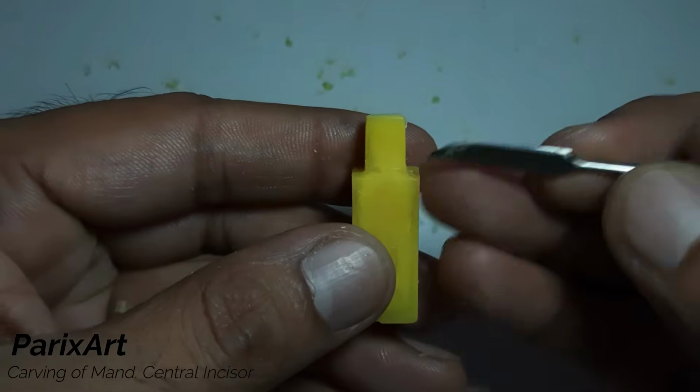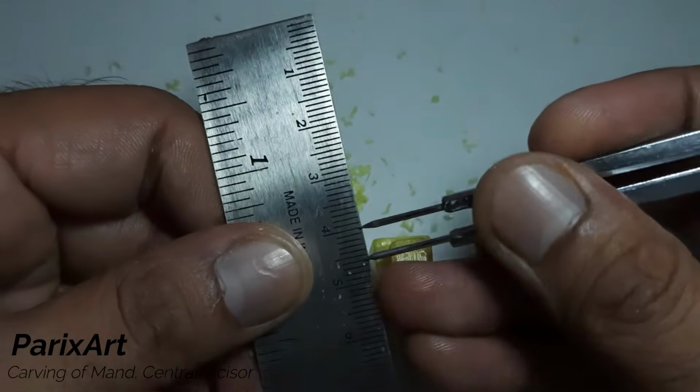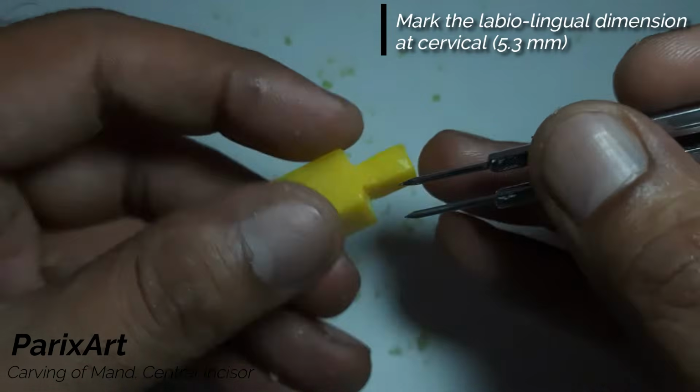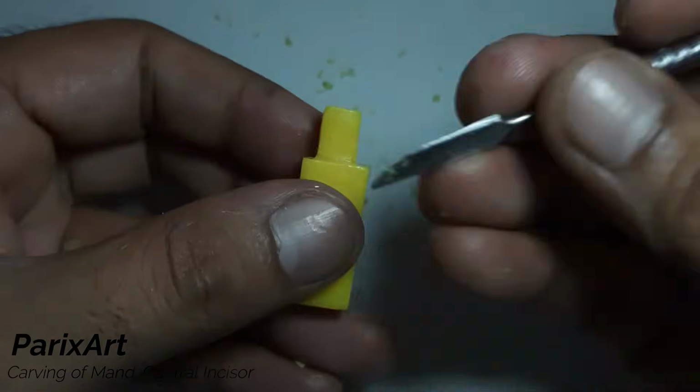Now we'll do the proximal aspect. Mark the labio-lingual dimension at cervical, that is slightly less than 5.5 mm. Make the notches at these markings.